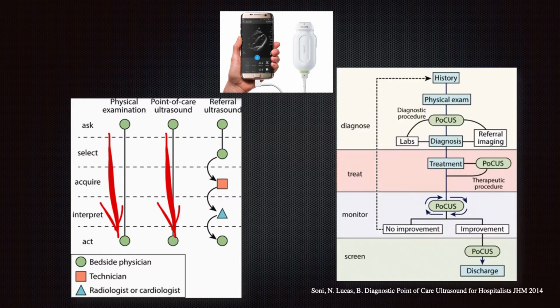mainly in time. Also, point-of-care ultrasound is used to assess and reassess the patient. Just like when you make a diagnosis of heart failure, you may diagnose that with POCUS, but also when you start your treatment with Lasix, you'll want to see that the pleural effusions are becoming less, the pulmonary edema is becoming less, the distension of the neck veins and the abdominal veins is becoming less. So you're often rescanning those people, and then at the time of discharge, really confirming that they truly are euvolemic.